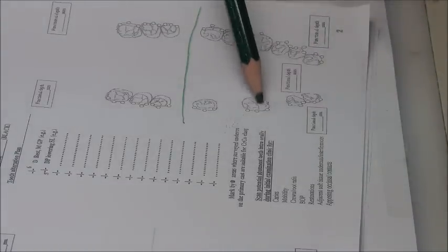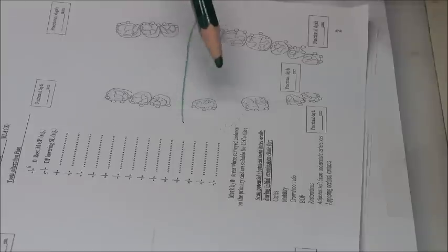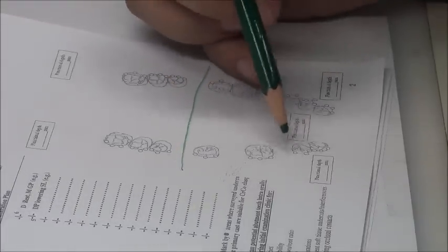This is called a pier abutment. P-I-E-R. It's an abutment with 2 saddles around it. This abutment has to hold some occlusal forces from it mesially or more occlusal forces on it distally. Right? It's going to take the occlusal forces of the mesial tooth that is missing and the distal tooth that is missing. So a lot of forces on this tooth. There are a lot of stress on this tooth.